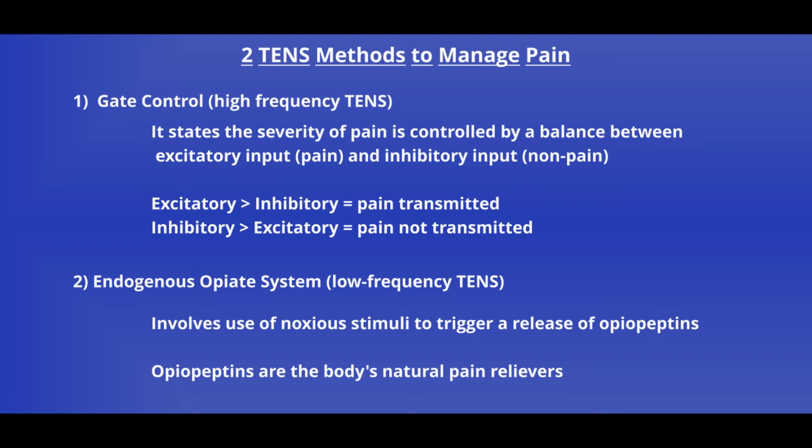High-frequency TENS is more comfortable, but only provides relief from pain while the stimulation is running. Low-frequency TENS is less comfortable, however the pain-reducing effects can last for several hours after treatment.